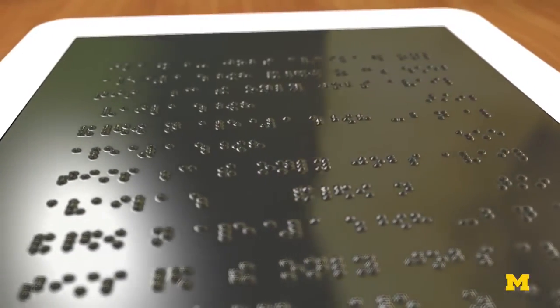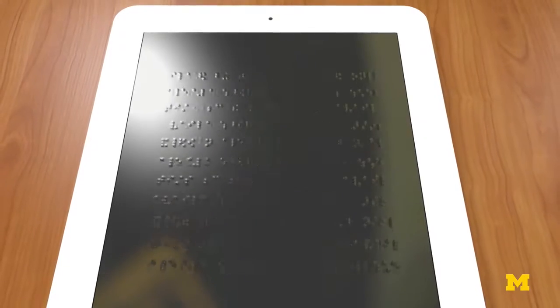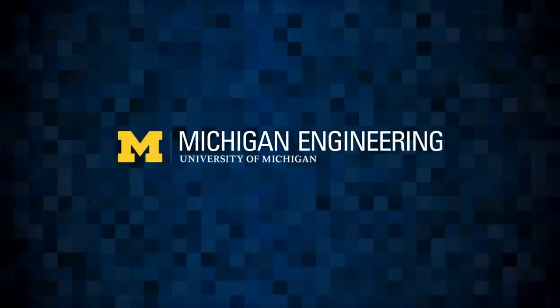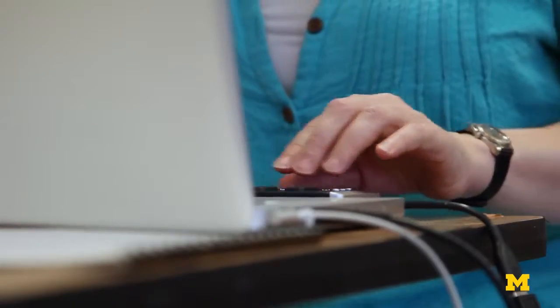Imagine having a Kindle that isn't a visual Kindle, but instead has a tactile surface that can be read by a person who's blind using braille. So in this project, what we're aiming to do is to create a full-page braille display that can be refreshed under computer control. Refreshable braille displays do exist, but they have a number of problems.